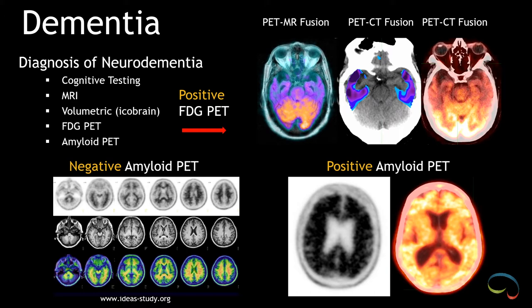This is an obvious case of a positive FDG brain PET CT. The image on the left is a PET MR fusion, which I fused to a FLAIR sequence, and the images on the right are PET CT fusion with color map overlay processed through the MIM Neuroanalysis software, and you see cortical hypometabolism in the bilateral temporal lobes. Occasionally, the patient is then referred for an amyloid PET study if there remains some kind of clinical ambiguity. I've read about 200 amyloid PET studies since 2016, as RadNet was one of the main sites for the IDEAS trial.